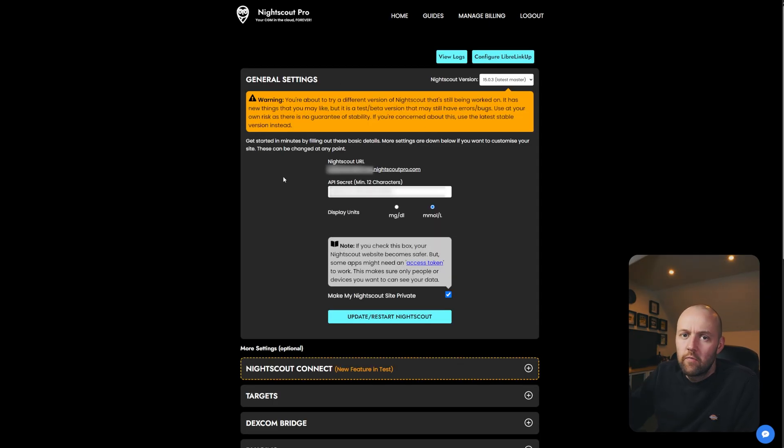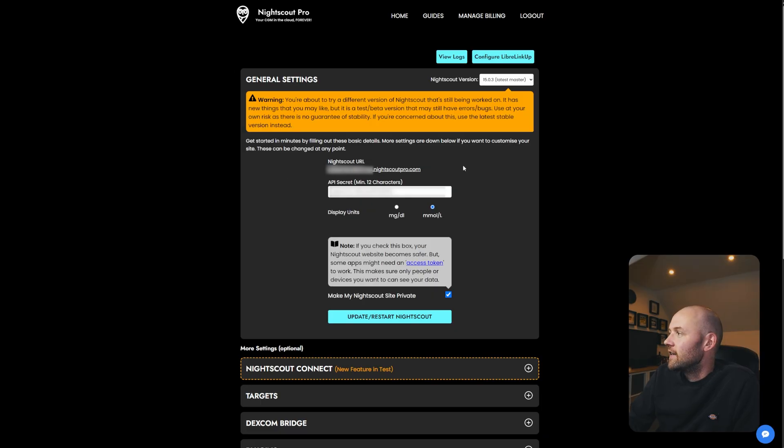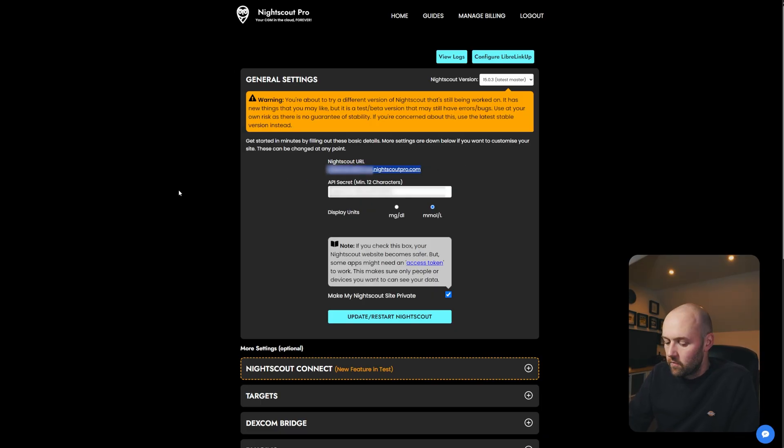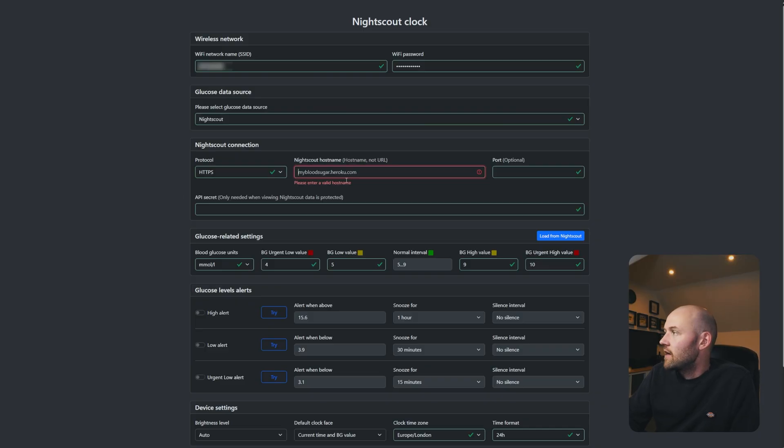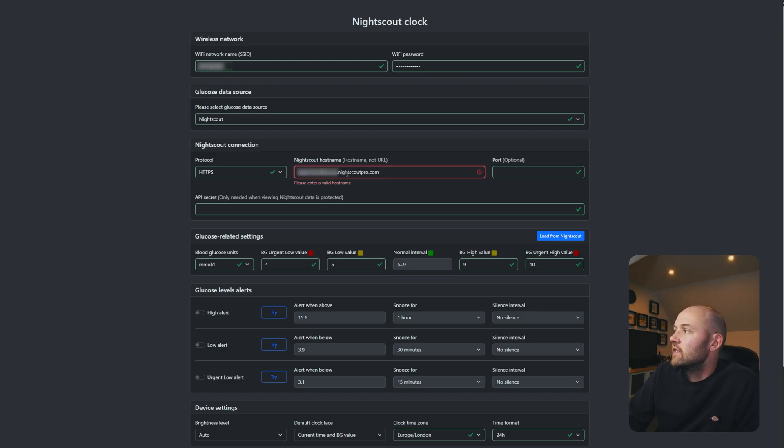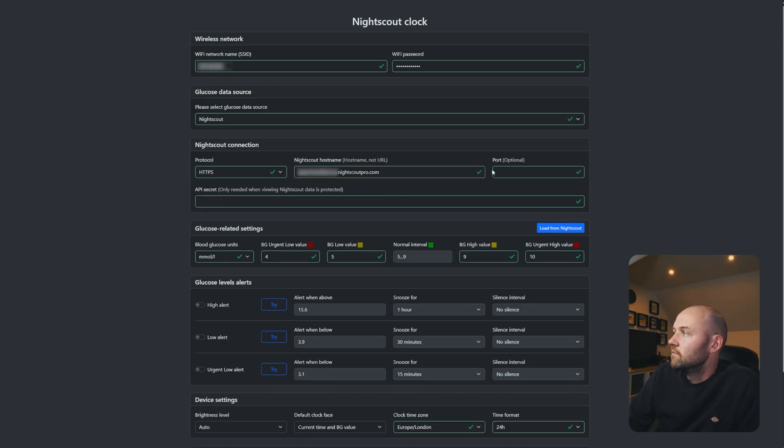It'll then display a number of bits of information. Some of this will be blurred out on screen just for data privacy, but what we're going to do is you're just going to copy the Nightscout URL from here and paste it into the Nightscout hostname part here.